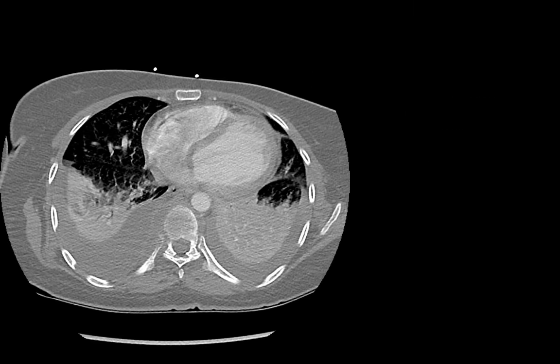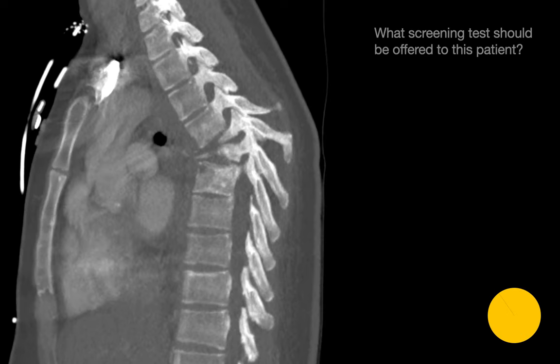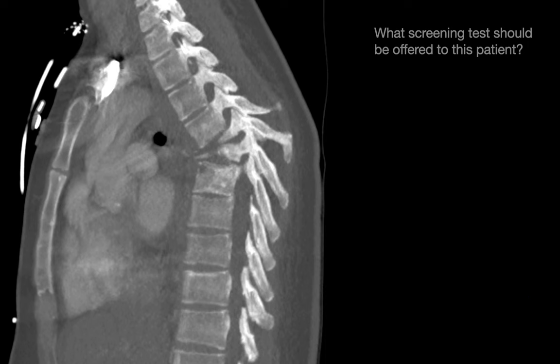On this patient's chest CT, this case of tuberculosis is presenting as bilateral consolidation and bilateral pleural effusions, which were eventually diagnosed as tubercular empyemas. What screening test would you offer this patient? For a patient with tuberculosis presenting as consolidation, tubercular empyemas, and Pott's disease, it'd be a good idea to screen for HIV.